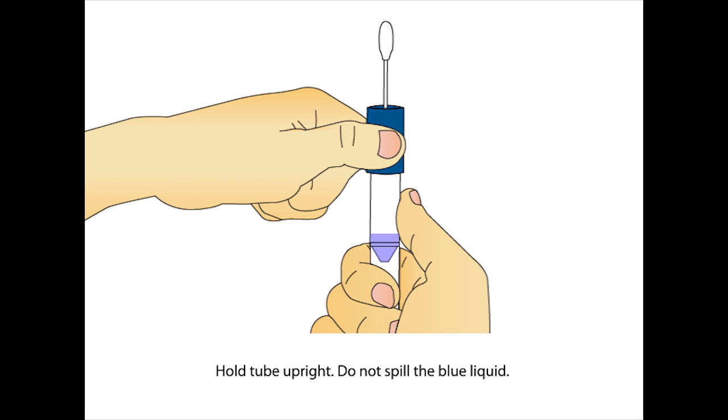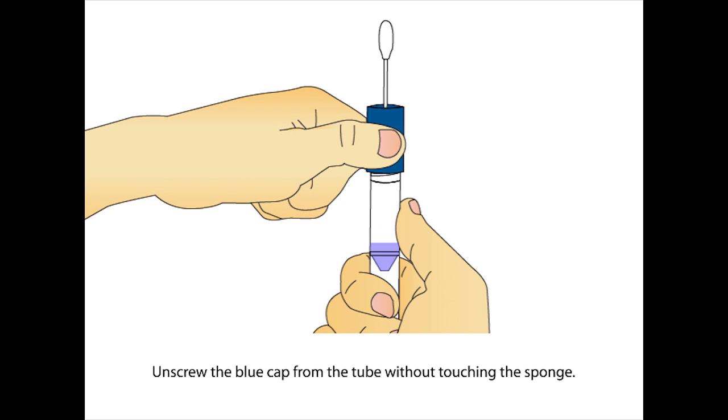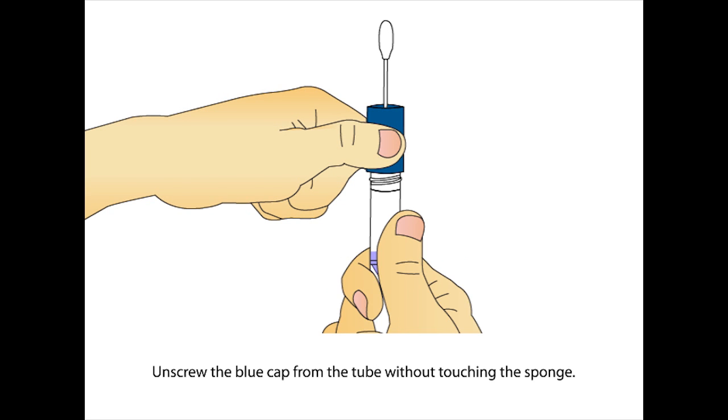Hold the tube upright to prevent the blue liquid inside the tube from spilling. Unscrew the blue cap from the tube without touching the sponge.